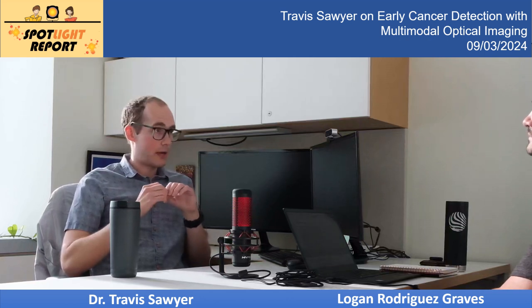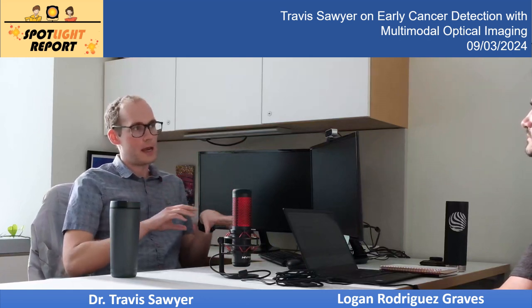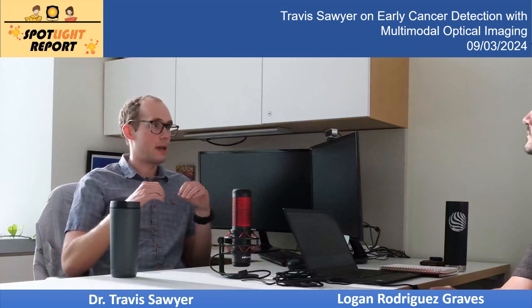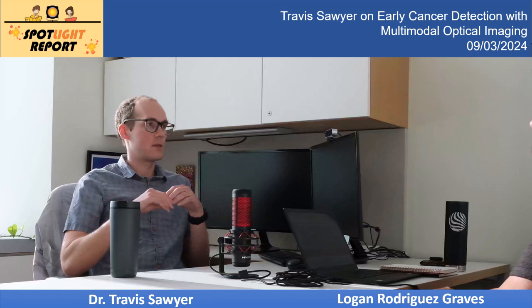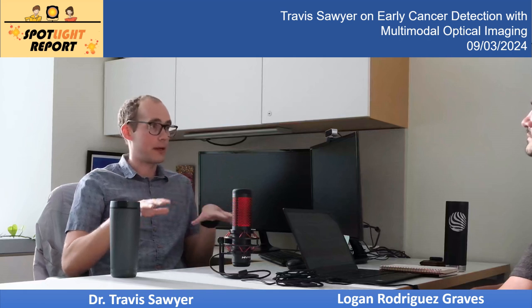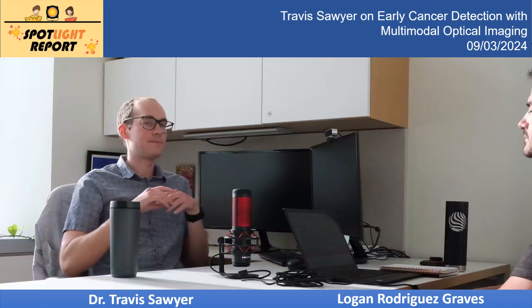Other contrast that we look at is fluorescence. That can either be some contrast agent where you inject it. I'm more interested in natural tissue fluorescence. Things like the metabolic process of cells produce these cofactors that naturally fluoresce in different wavelengths. By using spectral imaging or some kind of spectrally resolved detection method like spectroscopy, you can get a measure of how the metabolic activity is changing, which, when you have cancerous tissue, is usually quite active because it's trying to replicate itself.